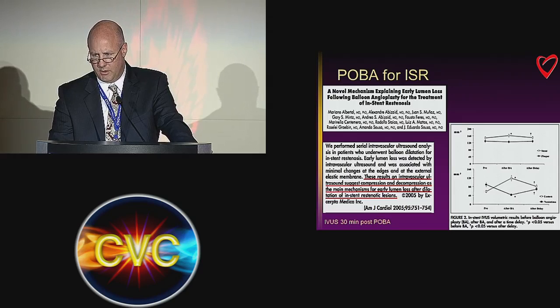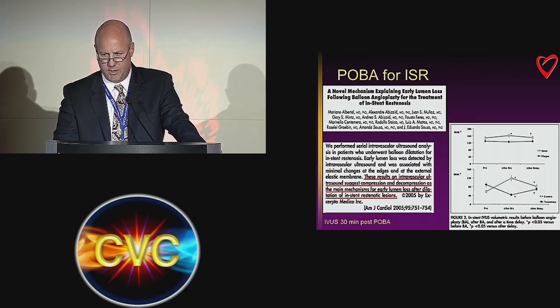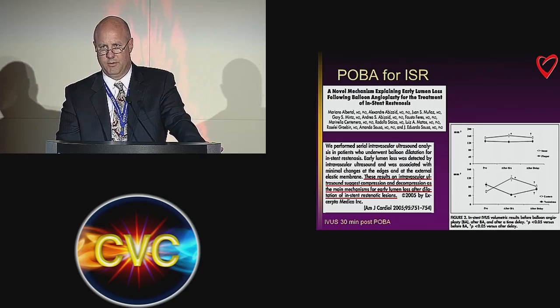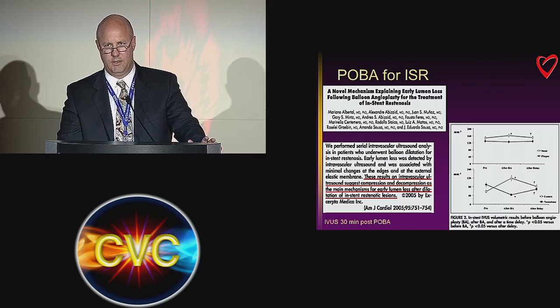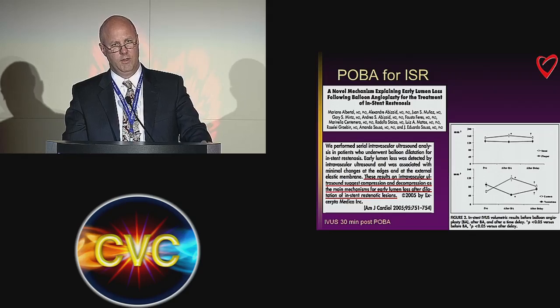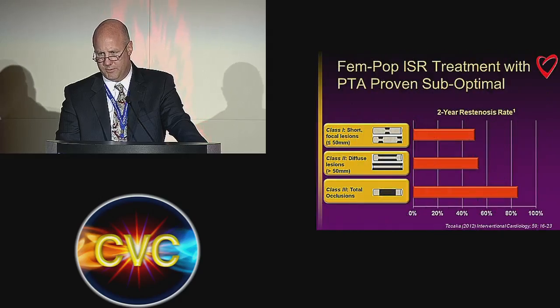And you can see in the middle section that immediately after balloon angioplasty, your luminal gain goes up, your neointimal area goes down. But 30 minutes later, you're pretty much back to where you started, because the plaque simply rehydrates. It reaccumulates the water, and so you've done nothing to the plaque. So we've known that balloon angioplasty doesn't work. So in context, the EXCITE study is really just a historical study to prove that you physically need to get rid of that tissue to make a difference, and that's really what we tried to accomplish.